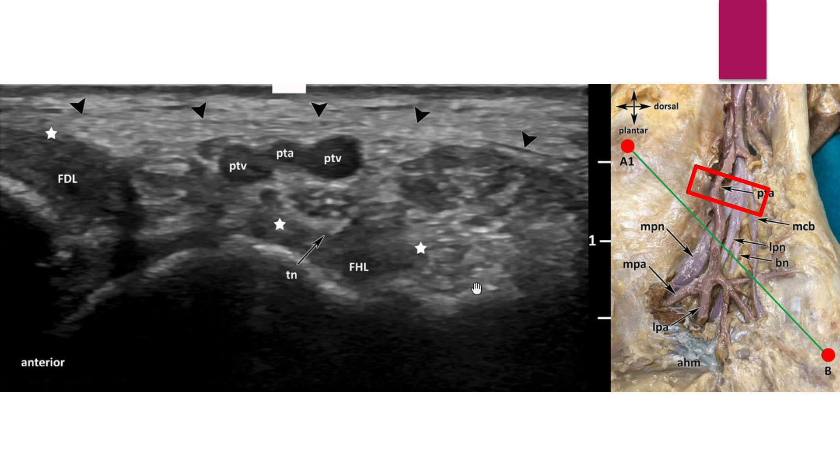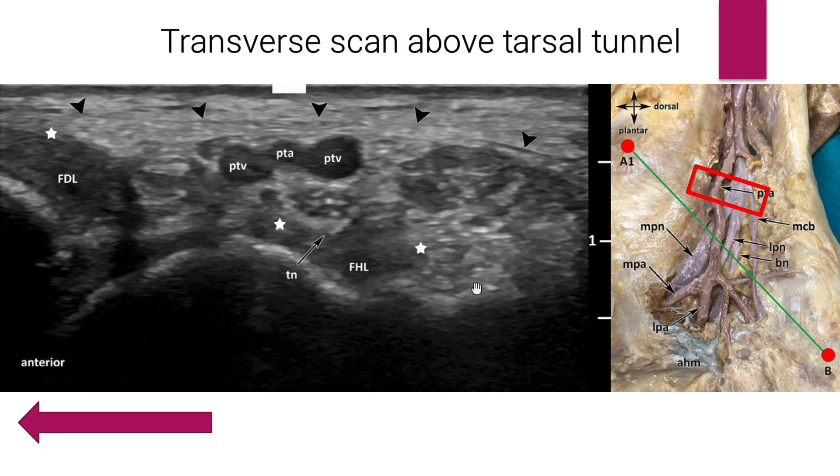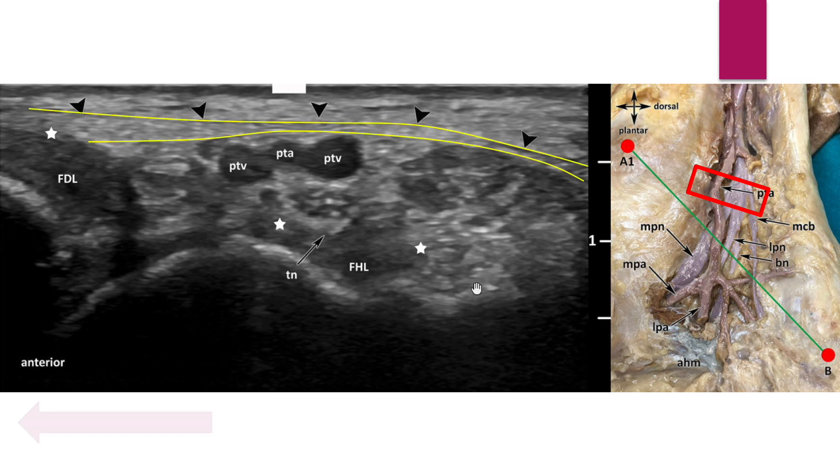Let's study the sonoanatomy according to level. The anterior direction is indicated. The left image is the transverse scan above the medial malleolar calcaneal line. The yellow line is the superficial layer of the retinaculum.